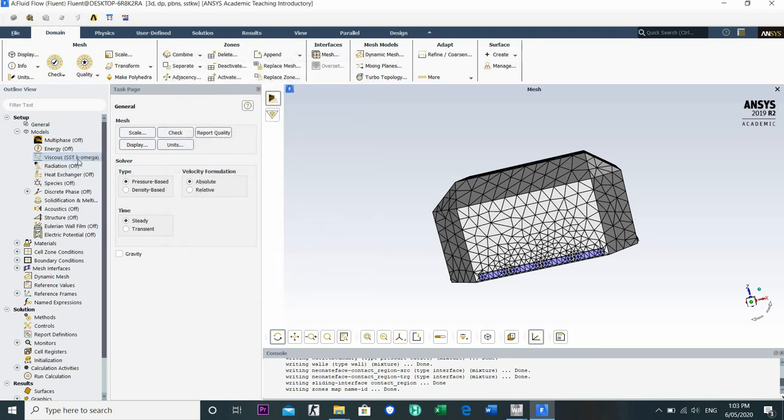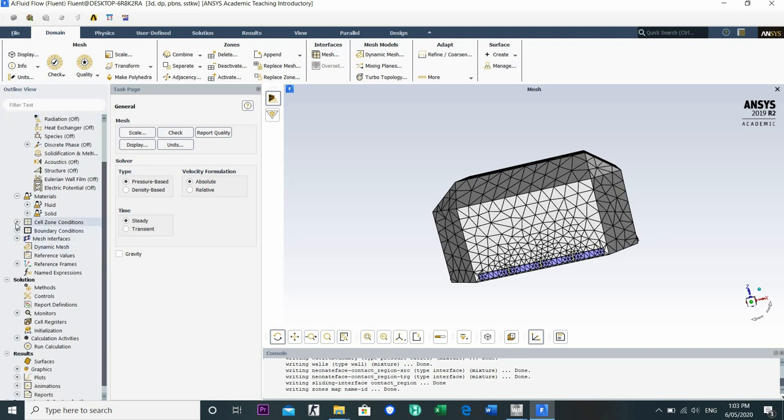This is SST k-omega. We are not going to change the fluid and solid. If you want to change them, you are able to do that. And then the cell zone condition is already right, fluid and solid.